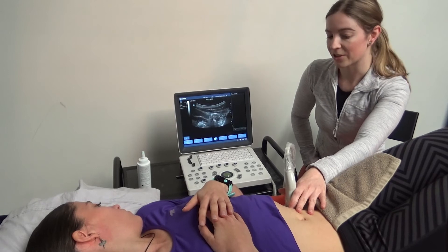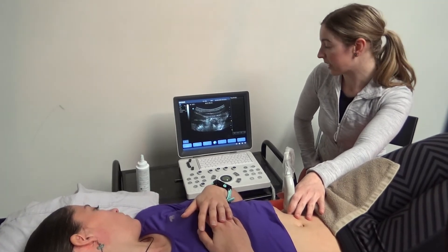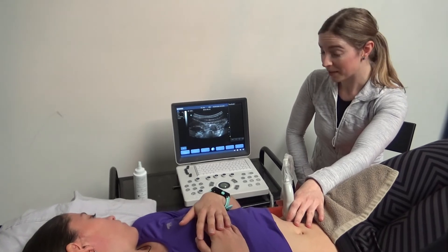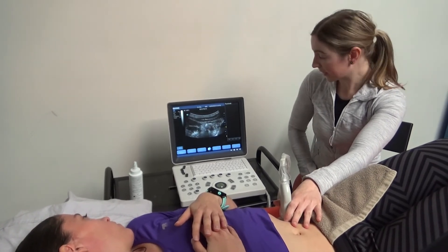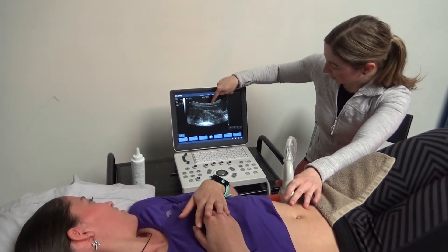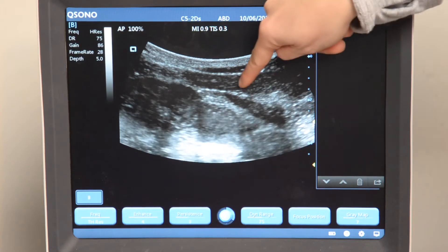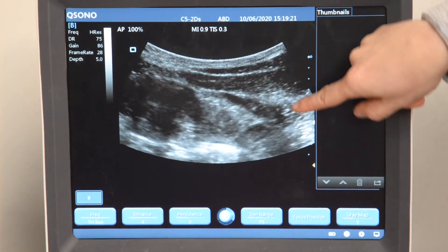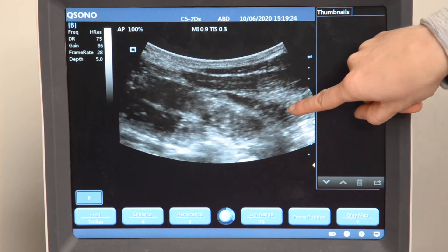I'm going to instruct the patient to first do an incorrect contraction. I want you to act like you're about to do a sit-up, so you're going to bulge your belly and we'll see what happens. We can see here with the incorrect contraction that you've got a lot of work happening in your internal oblique and there is some action into the transversus abdominis, but it's not very isolated.